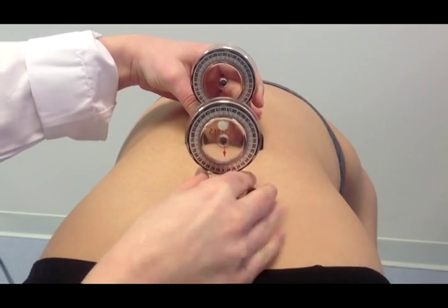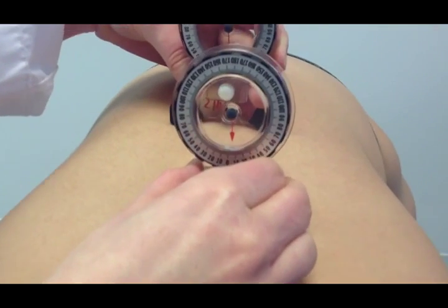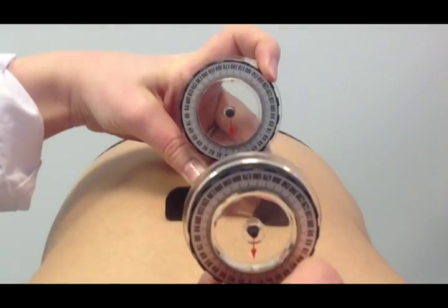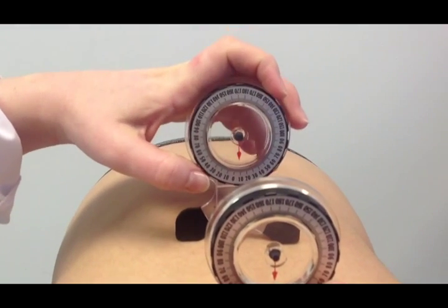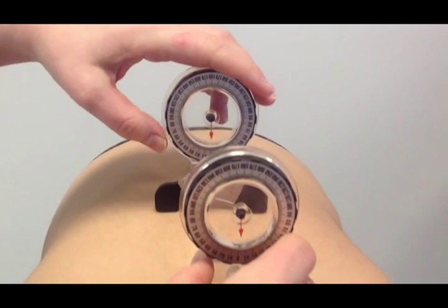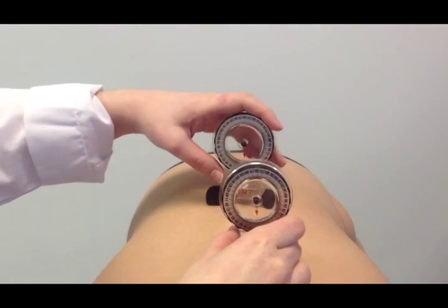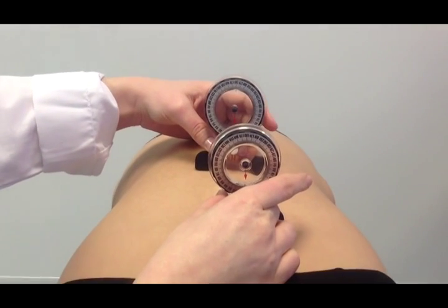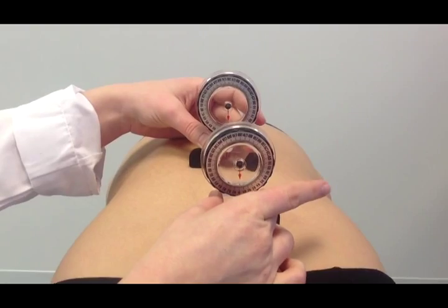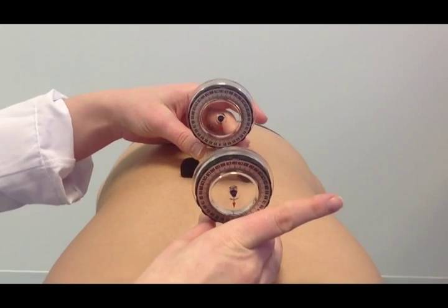You zero out the inclinometers by rotating the dial until it matches up with the red arrow. Once both inclinometers are at zero, you can have your patient rotate their shoulders. Mallory, will you rotate your shoulders as I demonstrated earlier?